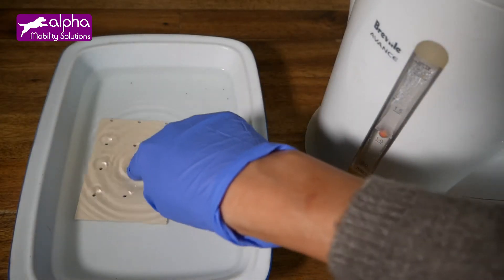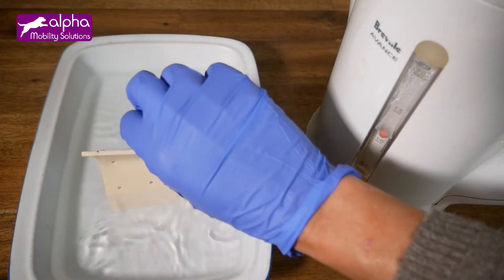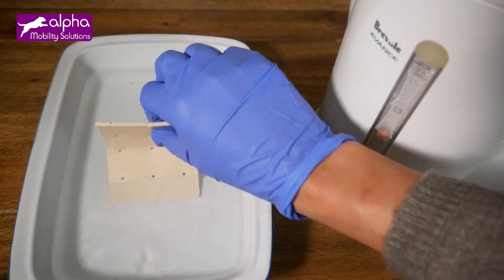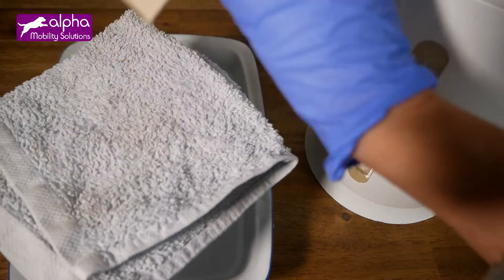Withdraw the sheet from the hot water. Be careful with heat — you may use a tool to remove it. As you can see, the sheet is soft and its temperature is not as high as the temperature of the water. You can touch it with your fingers.